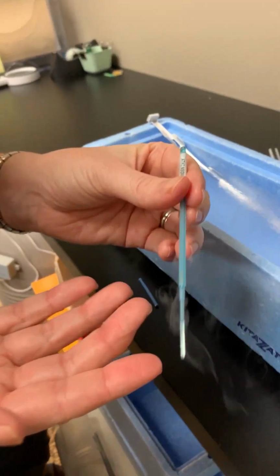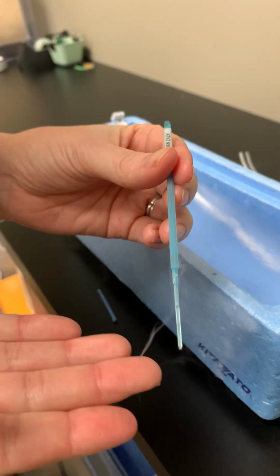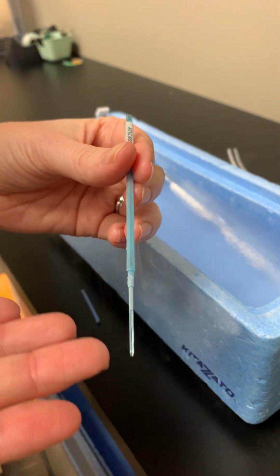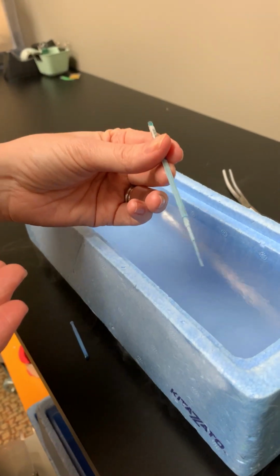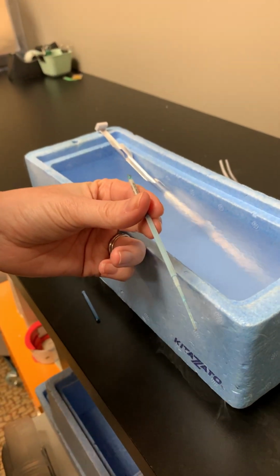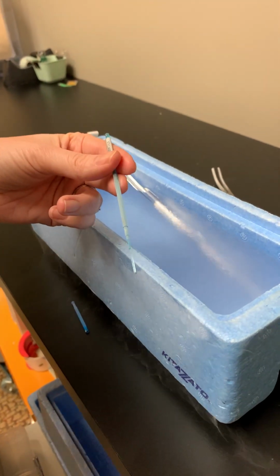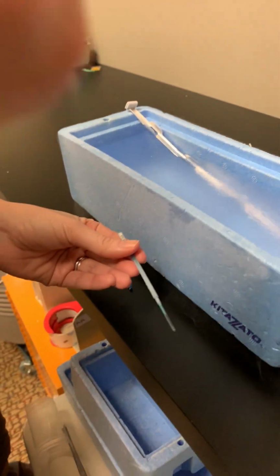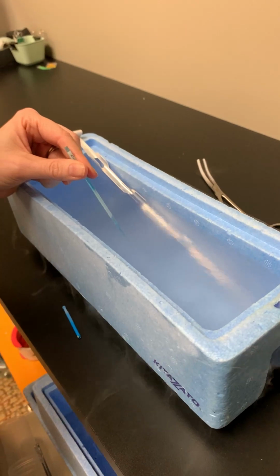Nothing's on it. Reminder. So there we go. So you would pull it out, and we would have used what's called a stripper with a stripper tip on it to pipette the embryos onto the tip of this device. And then when we go to thaw them, we would take it out, just like I showed you, and plunge it right into some media and get the embryos to come off and then take them through a series of drops to thaw them out. And kind of vice versa, when we freeze it, we would pipette it on there underneath the microscope, and then take it like that and just boom, put it straight into the liquid nitrogen.